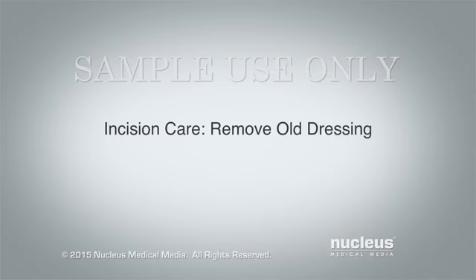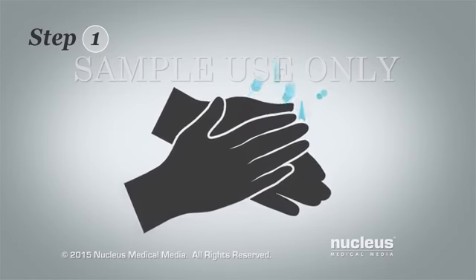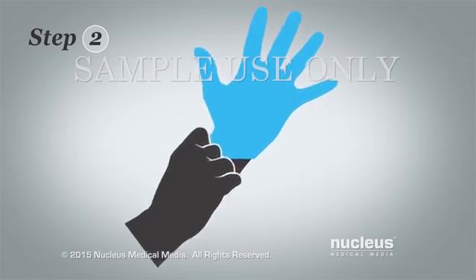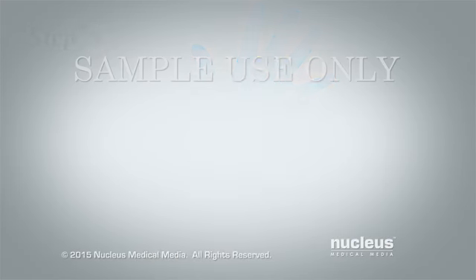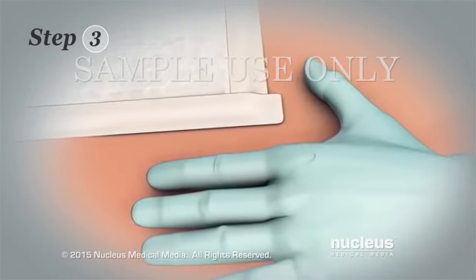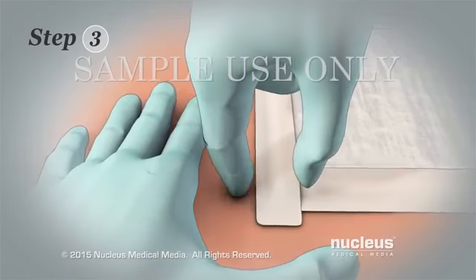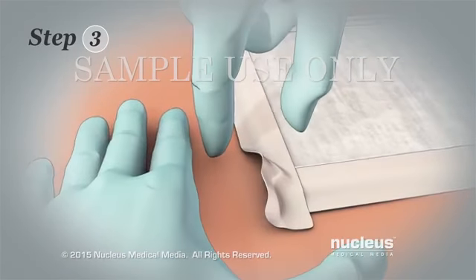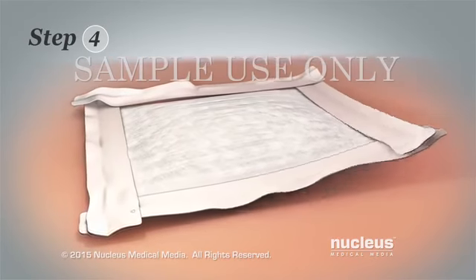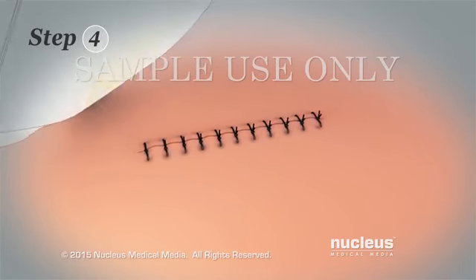Remove old dressing. Step 1. Wash your hands again with soap and water and then dry them. Step 2. Put on disposable gloves. Step 3. With one hand, press down gently on the skin next to the old tape around your incision. With the other hand, carefully peel away the old tape toward your incision. Step 4. After loosening all of the tape, remove your old dressing.